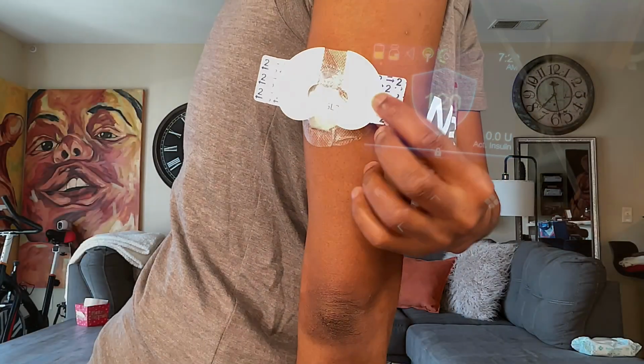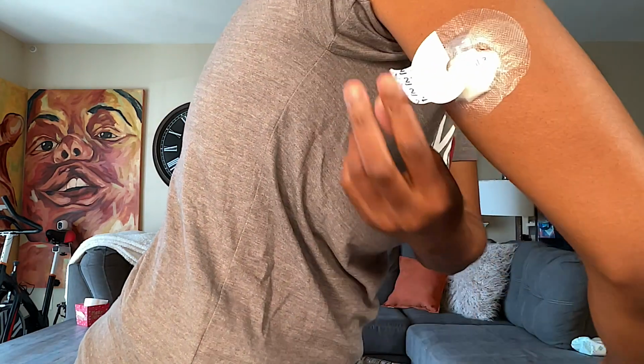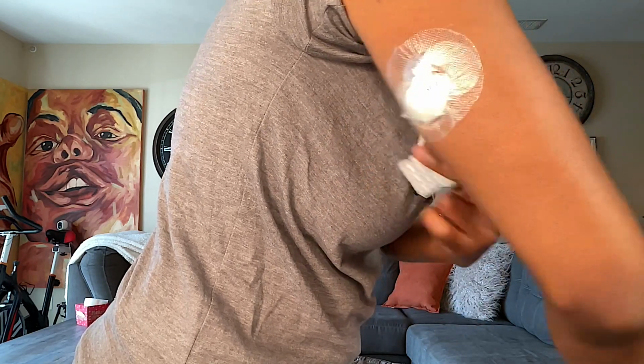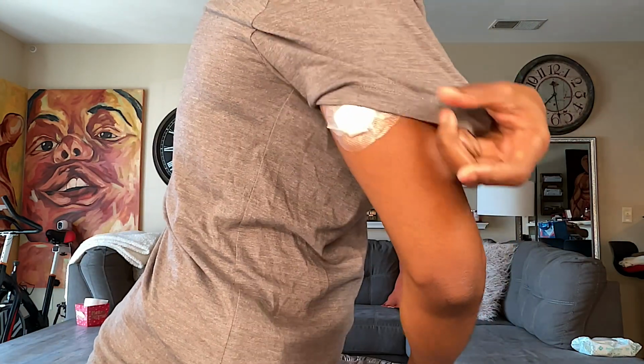So let's secure the sensor and the transmitter better by putting another adhesive on the top. This is what it looks like. So if you see me with this on my arm, that's what it is. And then I just cover it, and that's what it is. My new sensor. Well, I hope you learned something today.